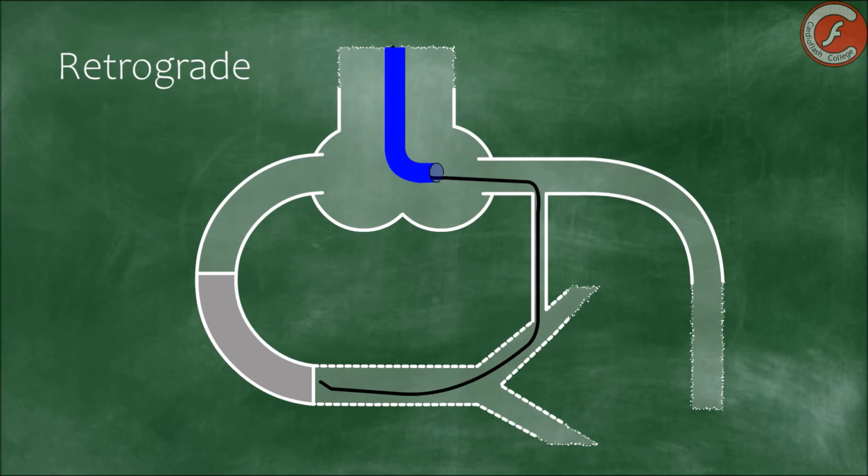Thus, it is recommended to use hydrophilic or polymer jacket coating guide wires to achieve this. However, even if these guide wires are great, they will not be able to meet their goal if they do not count with the help of a microcatheter.